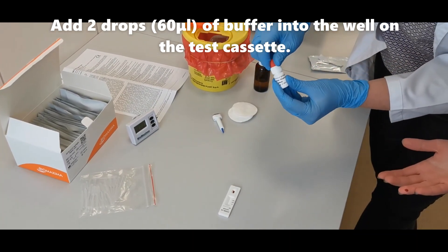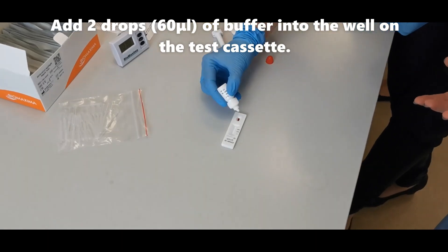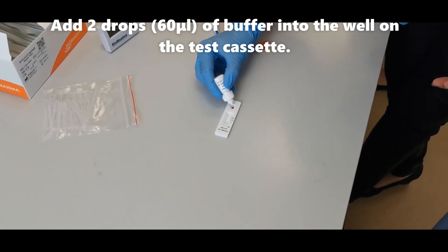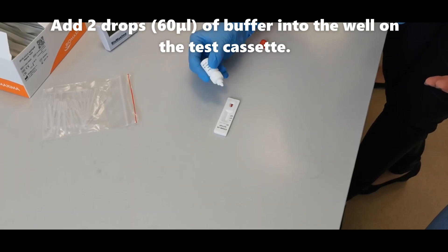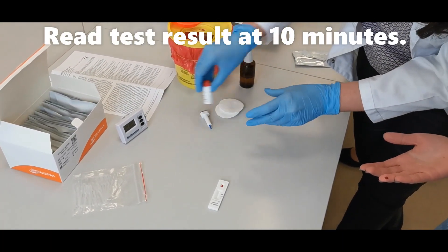Add two drops, about 60 microliters of buffer, into the well on the test cassette. Read the test result after 10 minutes.